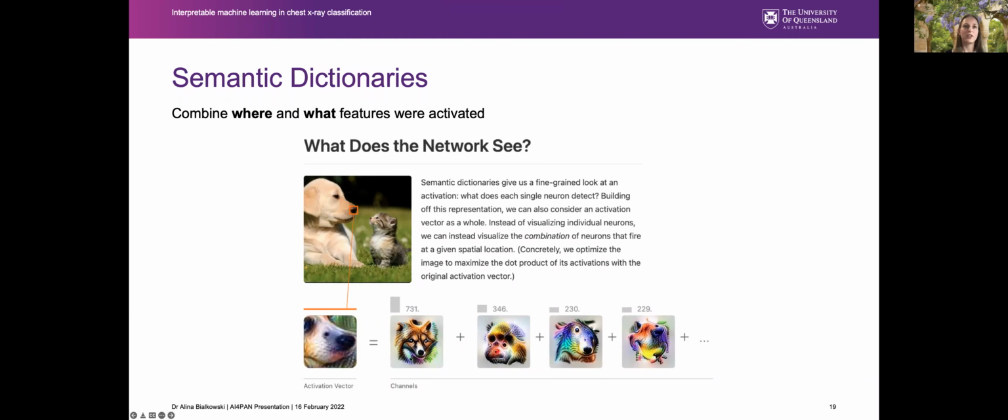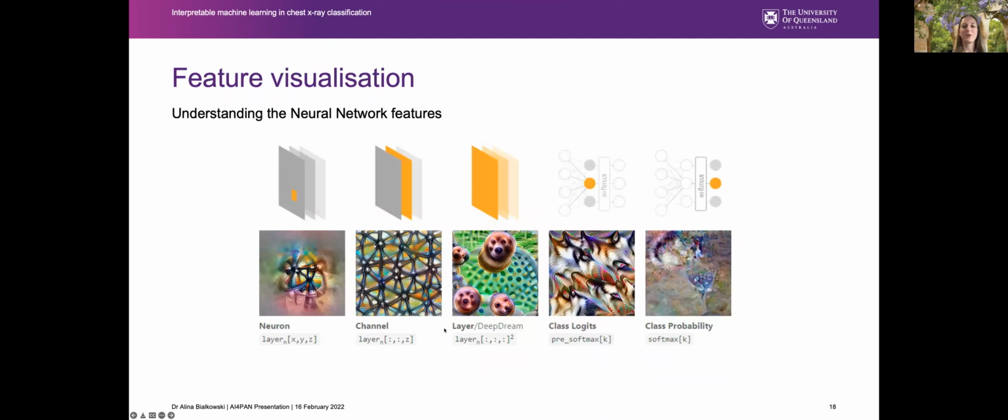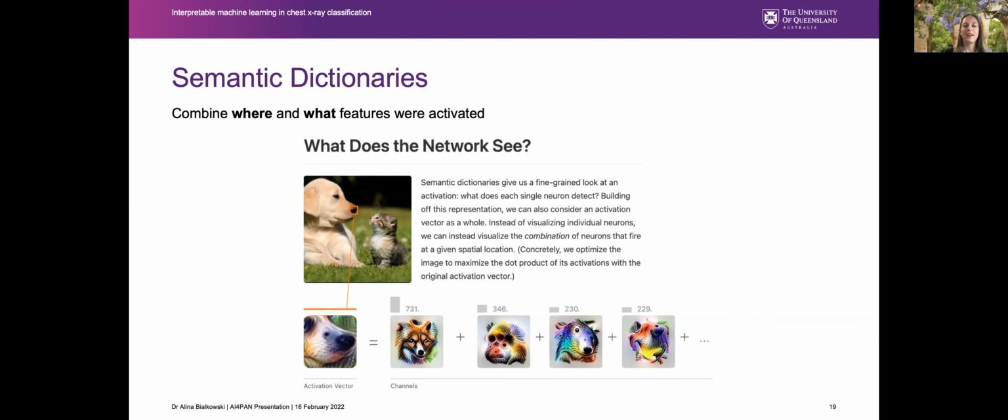So these are actually produced by reverse optimizing an image. Rather than trying to maximize your prediction to match the ground truth labels, you basically do the reverse. So you generate an image to maximize a neuron or channel or layer. And so we can get this distribution here. This is nice because we can see that this nose corresponds to nose-like features in this kind of weighting.